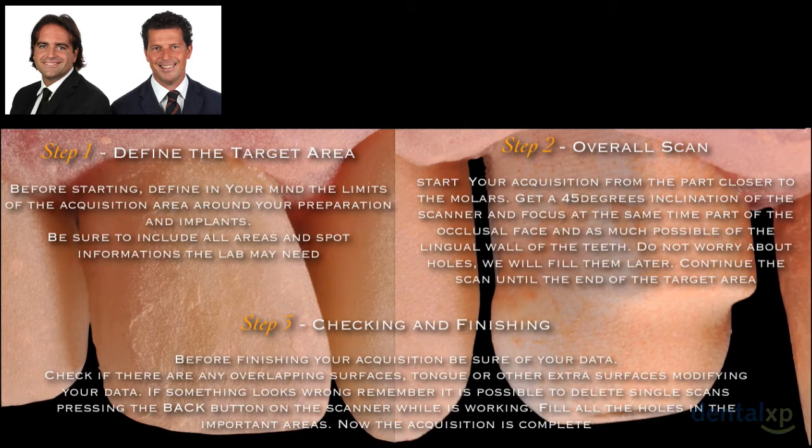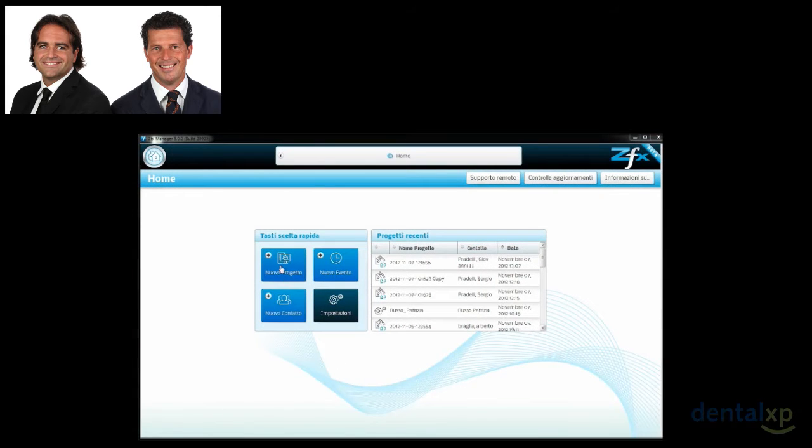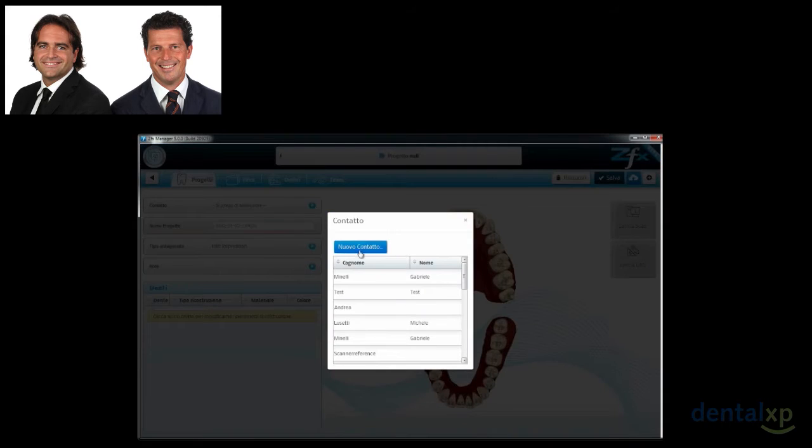And of course, one of the advantages is that if something looks wrong, and we don't like something that we're doing, we can always restart our scan from scratch, and we can retake all the areas or the information that we lost in the scan. It's very easy, and it's not time consuming at all. But the critical thing is that you have to have a scanning protocol, a scanning strategy. That is very important. So let's see with this short video exactly how that digital impression of that day went.